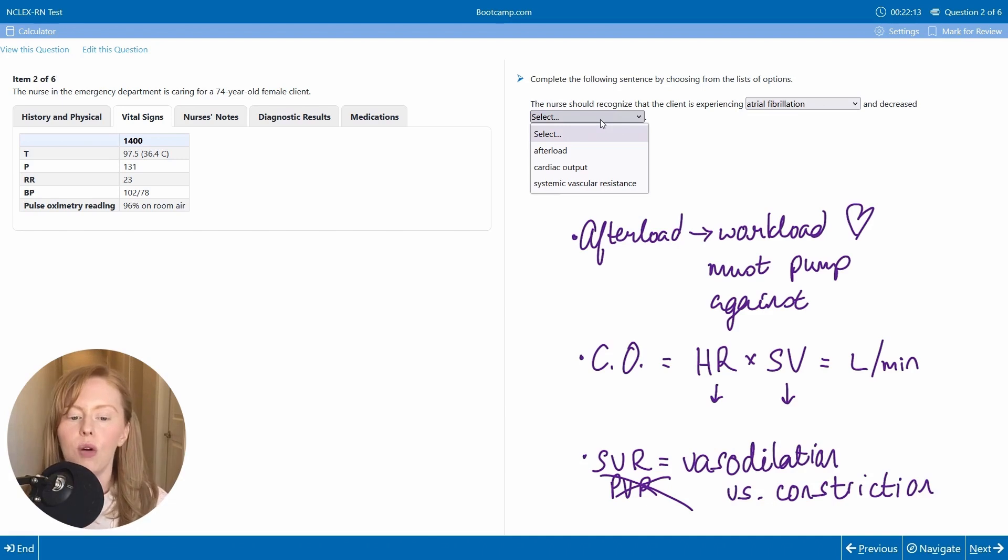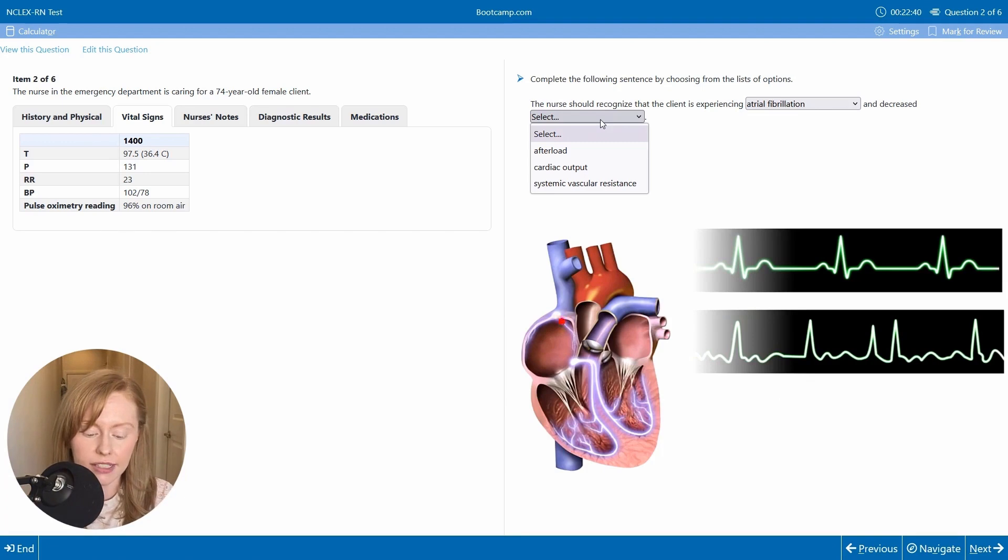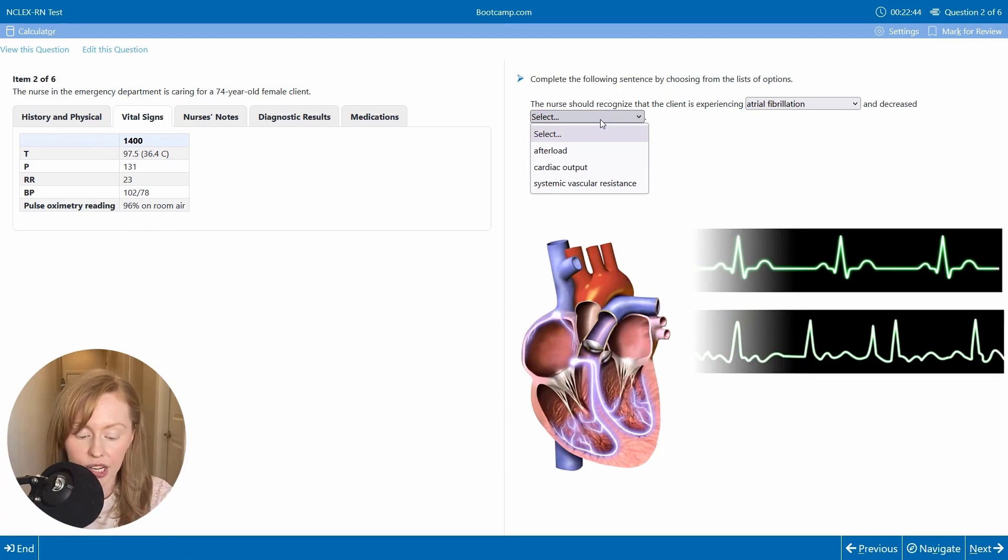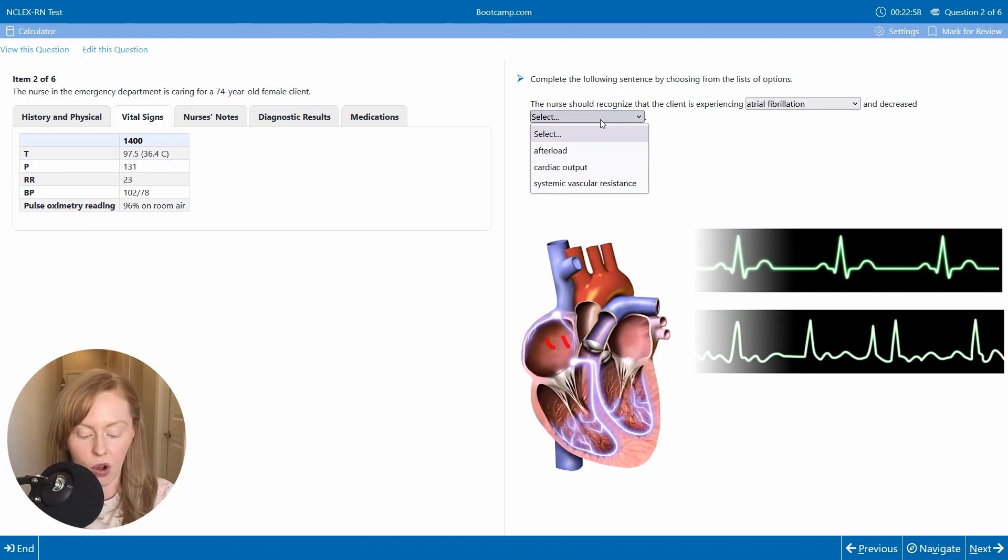So now which one of these would atrial fibrillation affect? In AFib, instead of this very controlled, regular stimulation from the SA node, you have got electrical discharges coming from all over the place.